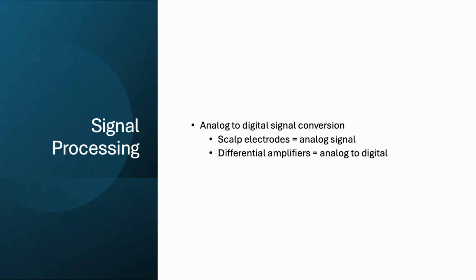Because our bodies run on AC current, which alternates between voltage or polarity regularly, electrodes on the surface of the scalp measure analog signals from continuously changing voltage, or amplitude, as a function of time, meaning that they have cycles, unlike DC. Differential amplifiers process the signals from two electrodes, an exploring electrode and a reference electrode, that can be considered electrical zero, or the electrical baseline. The processed signals are converted into a digital signal and recorded.